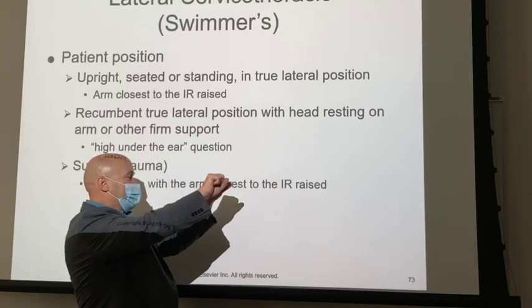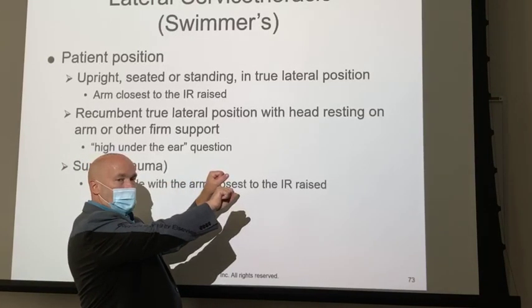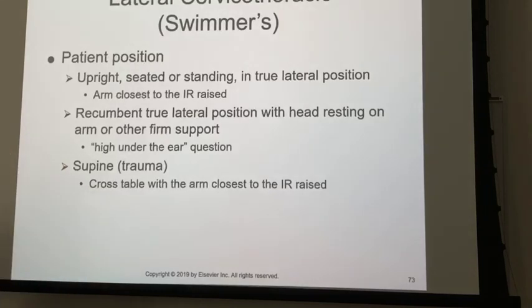And what that does is it takes the shoulders and moves them this way, but it also moves them that way a little bit so that you can see a little bit better, a tiny amount of oblique, okay? Because if you oblique too much, the radiologist is going to look at it and say, that's sloppy, go redo it. But if you oblique it just a little bit, he'll see it better and he won't even notice it's oblique.